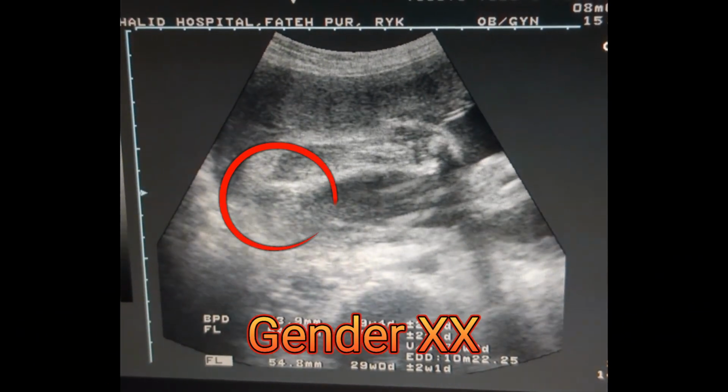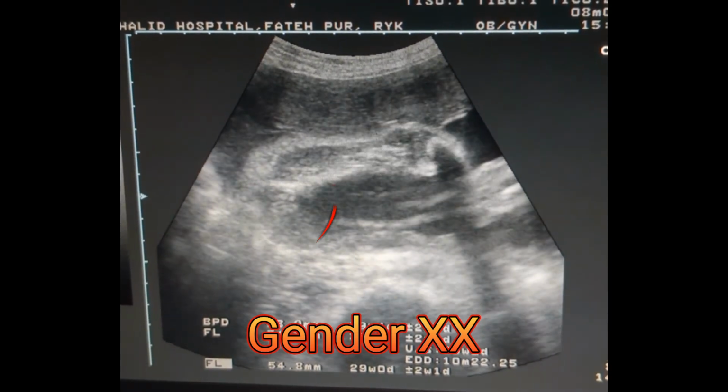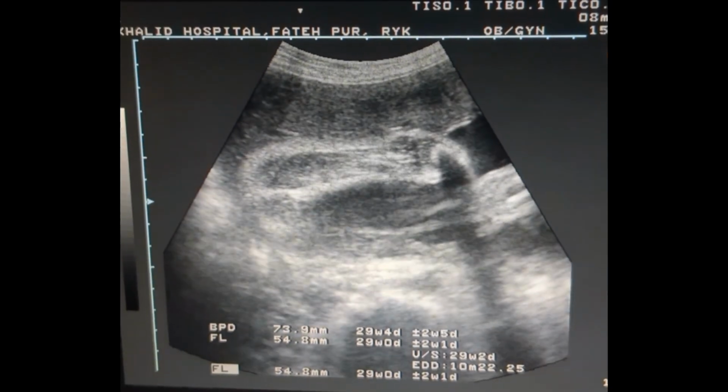We can also reveal fetal gender. The gender of this fetus is XX, female.